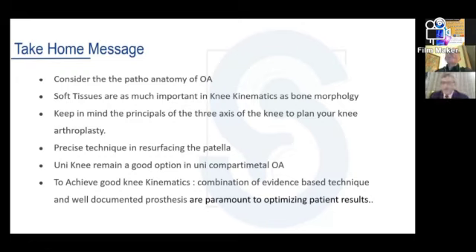But what about the failure rate in the high flex knee? The wear rate, I think, is much bigger in the high flex knee than the ordinary knee, or what do you think, sir? No, it's not much higher, but it depends.